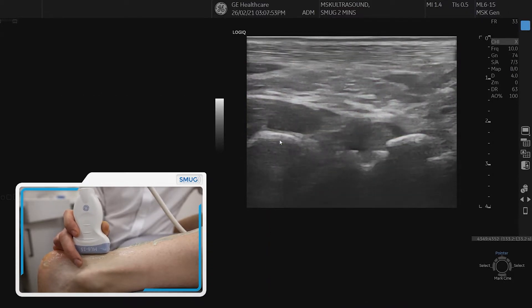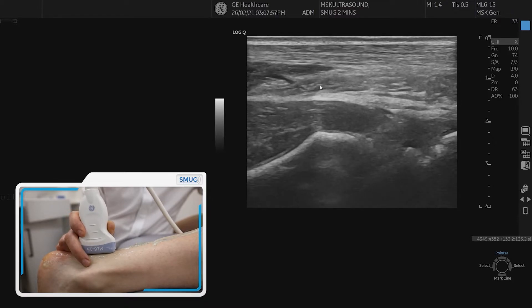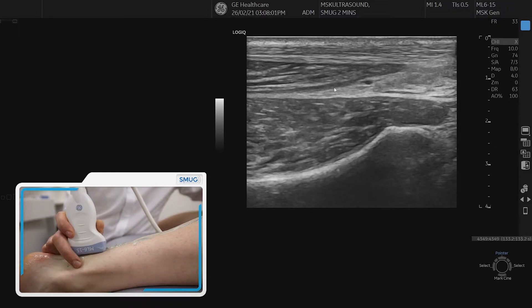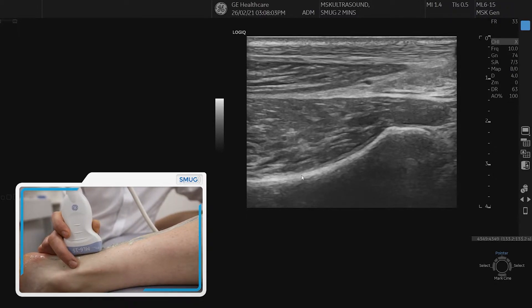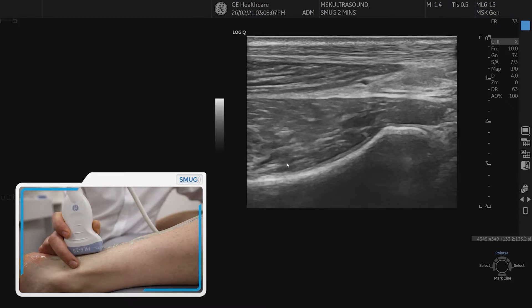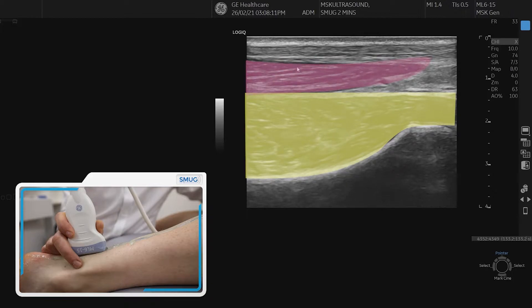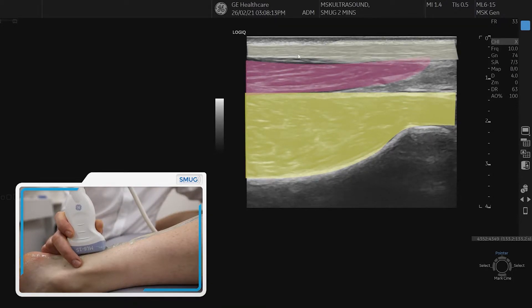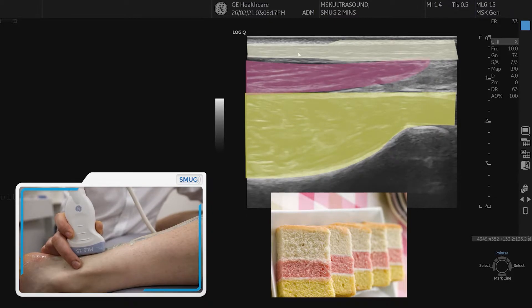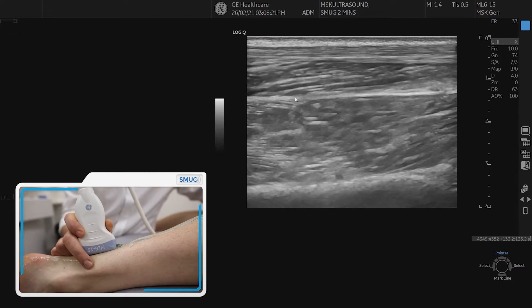Following more proximally, the Kager's fat pad gets smaller and is replaced with muscle fibers. The next middle angel cake layer is made up of FHL — wiggling the toe confirms it — along with soleus muscle fibers, and then the Achilles tendon on top. Moving the foot into plantarflexion and dorsiflexion allows you to see these layers moving on each other.